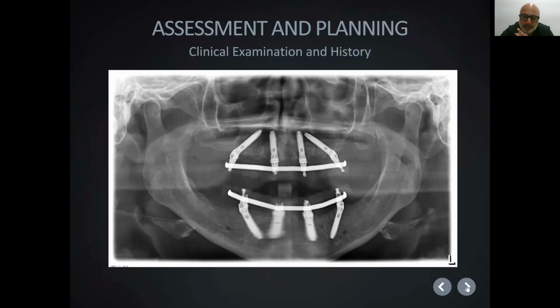And we're intending to place bridges that only go from 6 to 6 in each jaw to compensate for the 30 degree angle and to realign those multi-units. They're the connectors that are on top of the implants. We use 30-degree ones at the end so that they're straight again and it has the same path of insertion.